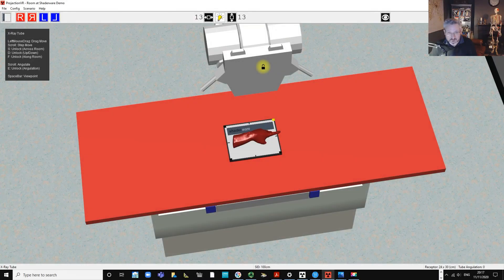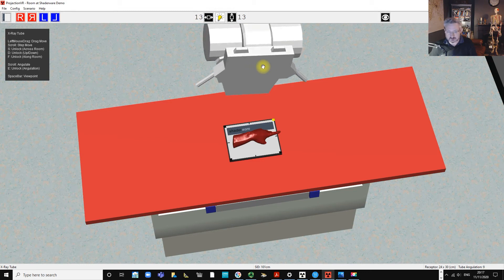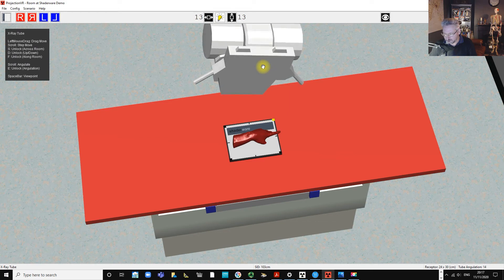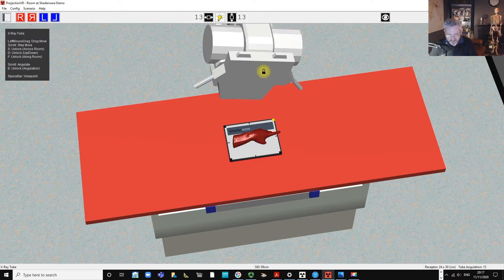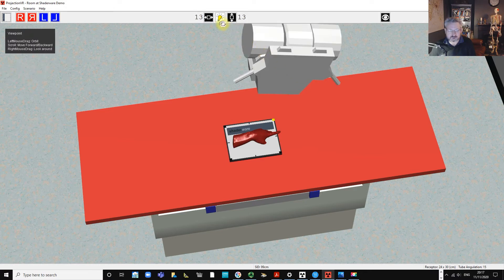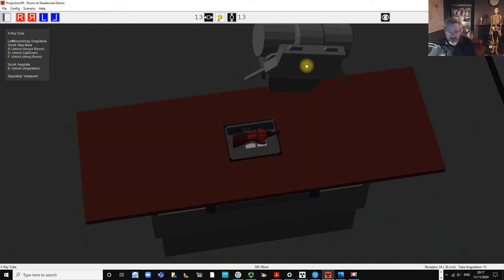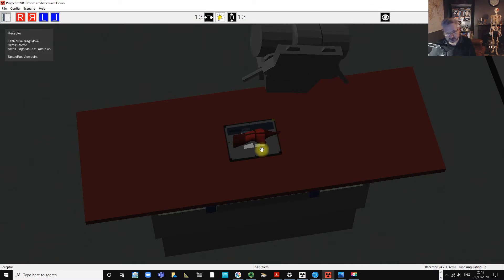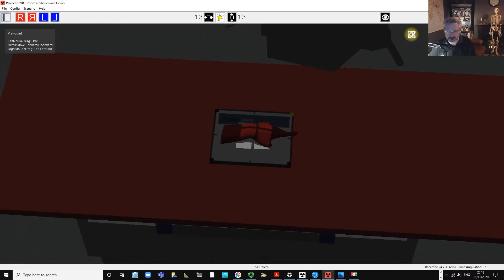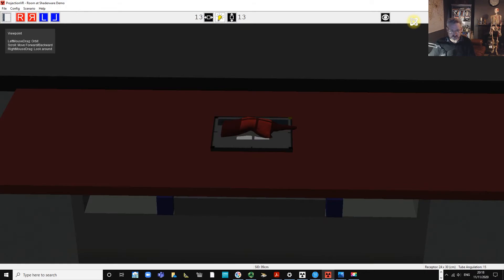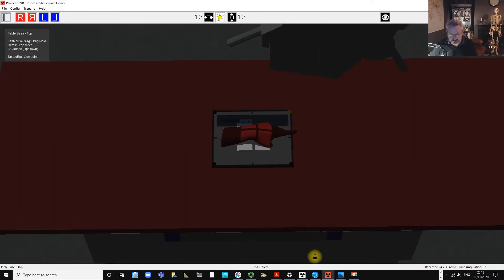For the next image, we keep the same scenario but angle the tube towards the elbow — some books say 15 degrees, some say 20, some say 25. What we're trying to achieve is to elongate the scaphoid. In some books this is called the axial scaphoid, but it's not truly axial because for a projection to be a true axial, the receptor has to be in the axial plane — and it isn't, it's in the coronal plane as is normal for most radiographs. We'll give this 15 degrees and have a look.